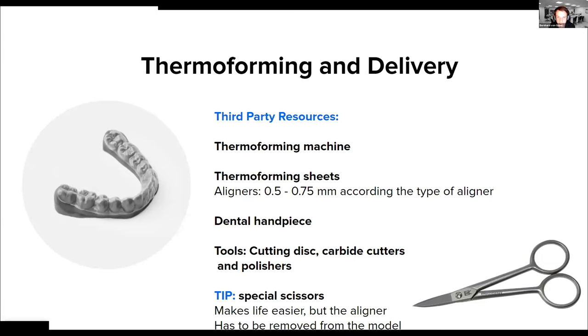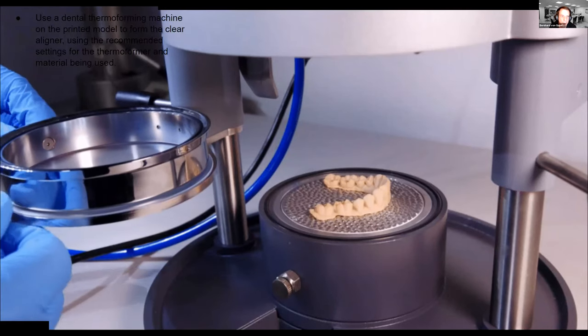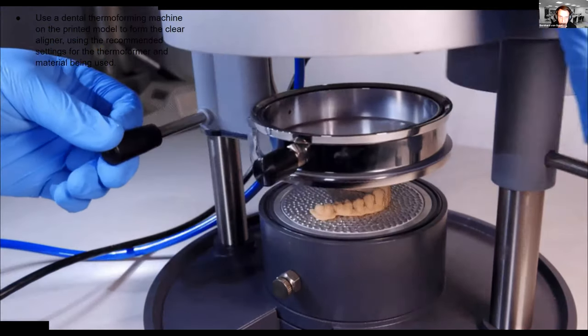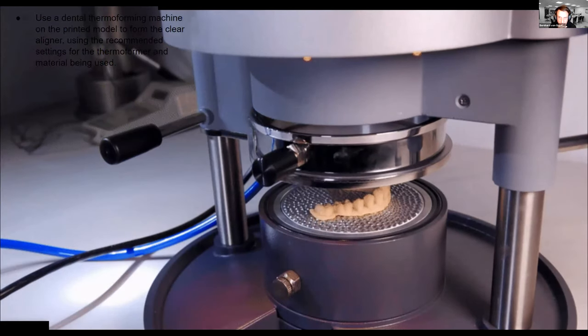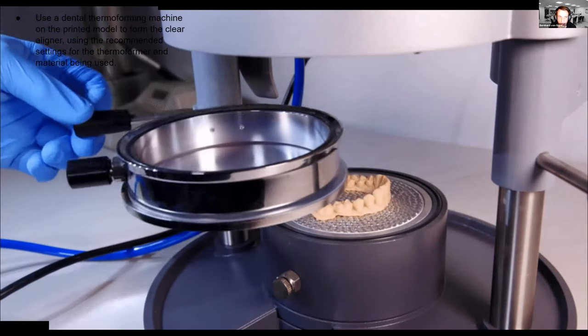And the final thickness, by the way, is reduced by the thermoforming process. And from my side, I'm not a big fan of cutting thermoformed discs with a cutting disc. I like to use scissors because they're not heating up the material. And the downside of this being that you have to remove the retainer from the model first in order to get with your scissors to the edge. So, and then we're starting with the thermoforming process. This may be familiar to many of you. You can use any dental thermoforming machine. And you will have to use the recommended settings from the manufacturer of the machine and the sheets.